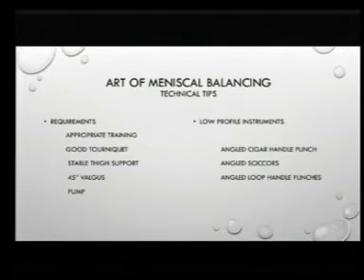And these are the three instruments which I feel are very helpful to do a good partial meniscectomy: angled cigar handle punch, you will see in the next slide how it's used, angled scissors, and loop handle punches. And these have to be really low profile instruments, so that your damage to the articular cartilage is kept to the minimum.